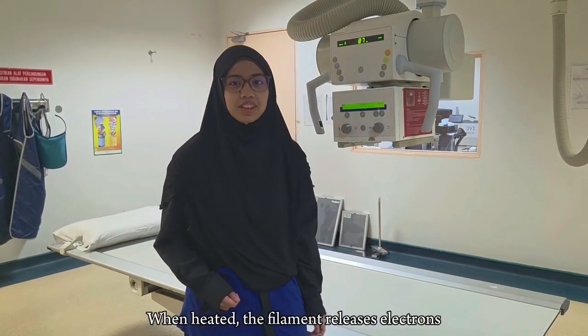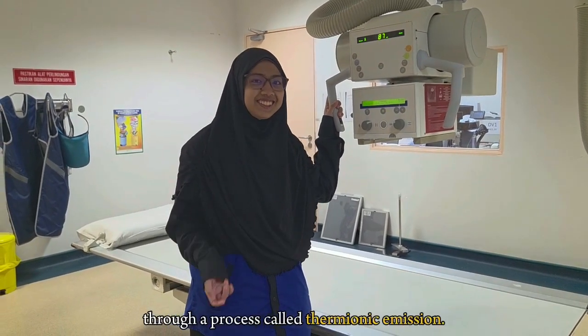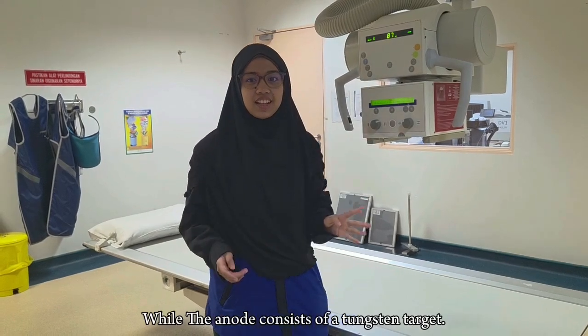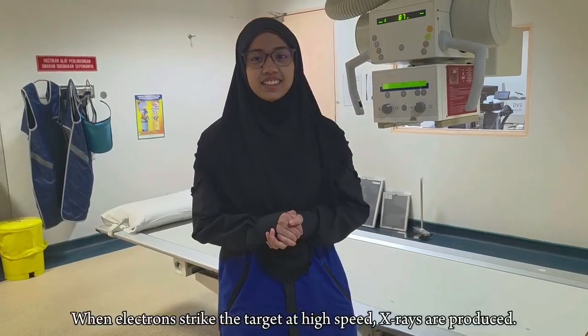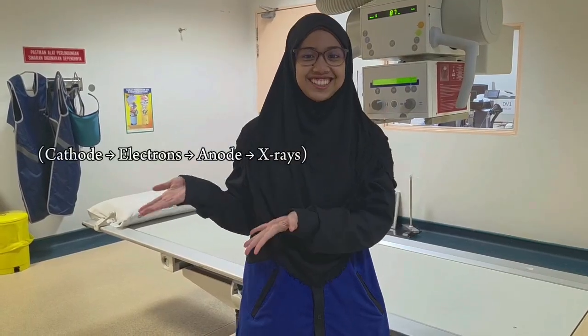When heated, the filament releases electrons through a process called thermionic emission, while the anode consists of a tungsten target. When electrons strike the target at high speed, X-rays are produced. This is how it works in order.